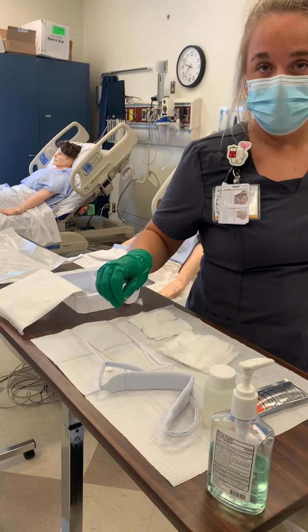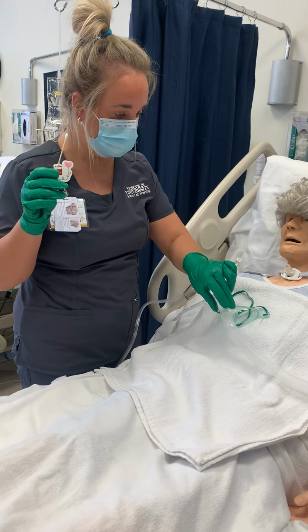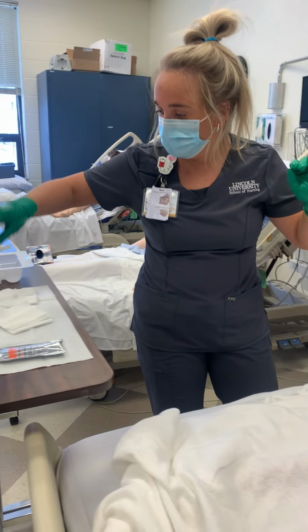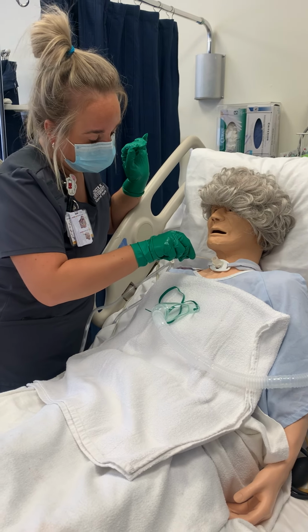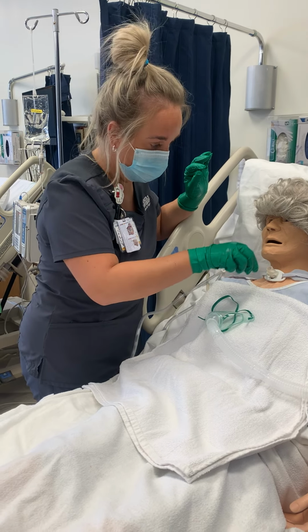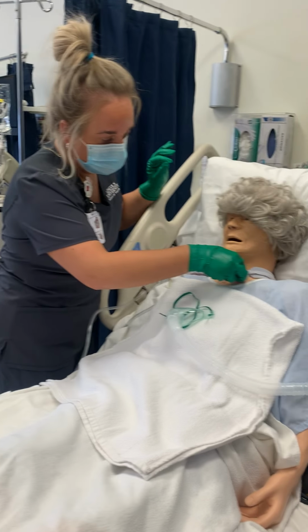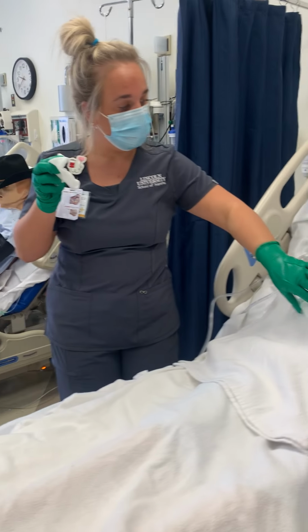So again, just with this clean hand, making sure I'm staying clean with this one, I'm gonna remove this and we're gonna clean around the trach, making sure to remove any of those secretions that I see. Also, if the trach were to become dislodged, I want to make sure that I had the same size trach and a size smaller, just in case. Cleaning that, then I want to make sure that I dry it really well, just getting under there and drying it. Place the oxygen back on.